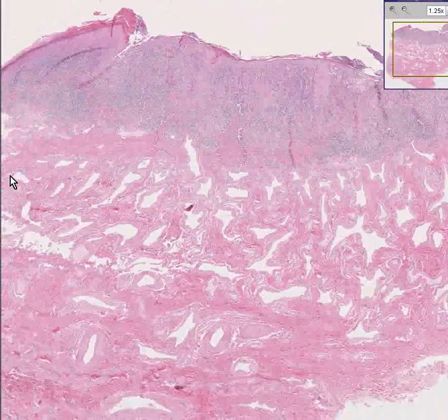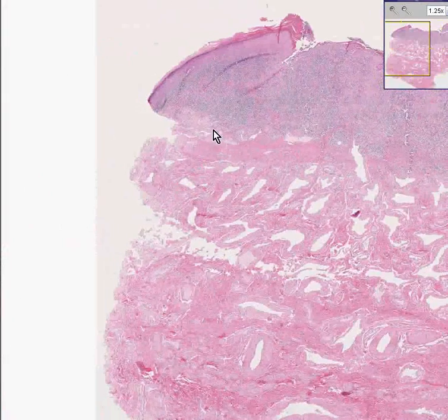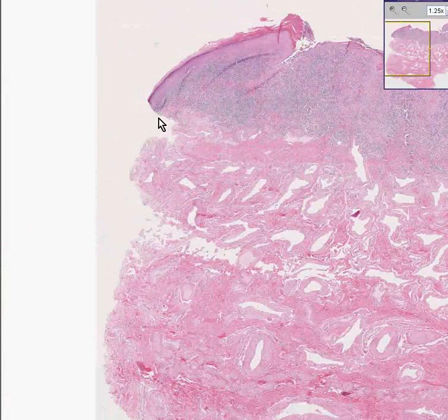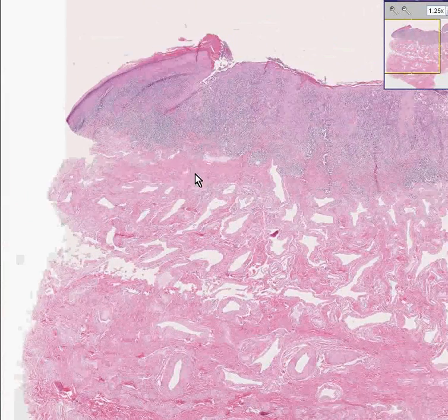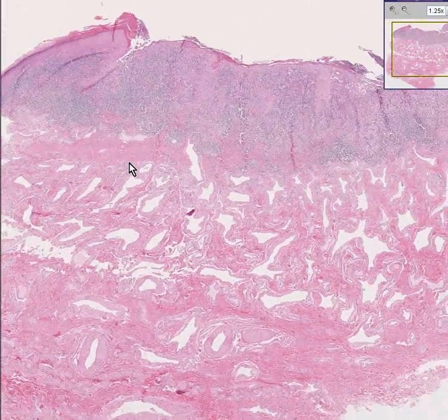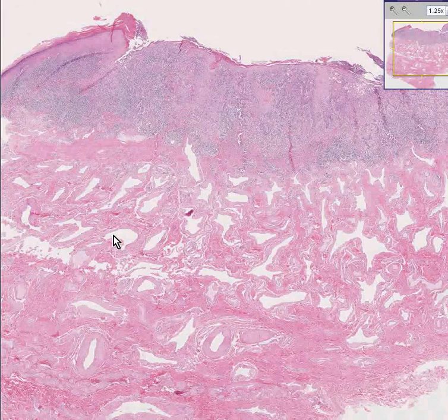Another thing you could say is that it doesn't look like it extends to any of the peripheral margins either — infiltrating squamous cell carcinoma of the penis.